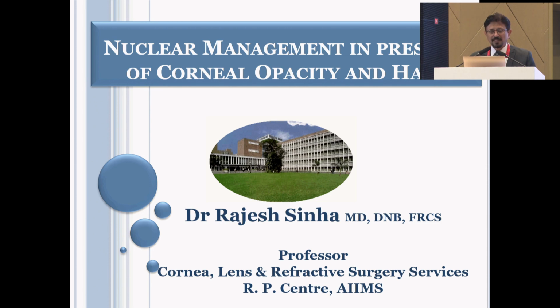Very good morning to all of you. Thank you, sir, for having me in this wonderful course. I'll be presenting to you about how to manage cataracts when you have an associated corneal opacity or haze.